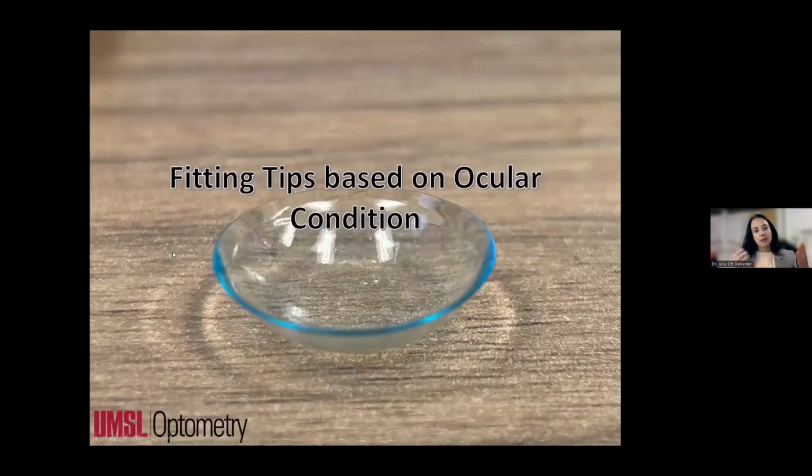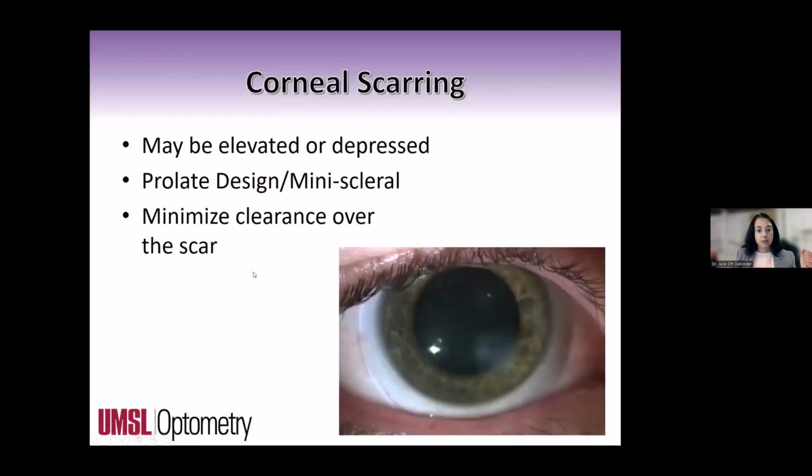I truly think it overestimates. And also, by the time I took that picture, did all that analysis, and then determined what sagittal depth I needed to put on my patient's eye, I'm going to be very honest with you. By using either the manufacturer's guidelines or going flatter than the flat K, I've already worked smarter, because I've already got that lens on the eye and I'm probably already evaluating it and getting ready to over refract it or vice versa, while that other person is still messing around with the OCT. So that's one of the other reasons I don't use it. I think it's very interesting to look at, but I find it to be a little bit of a time suck.